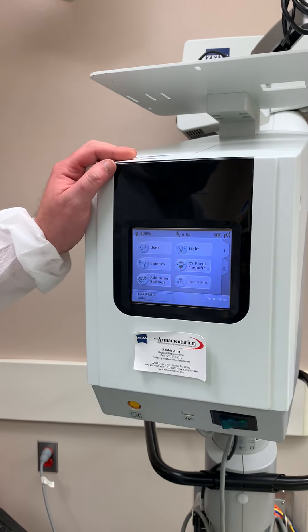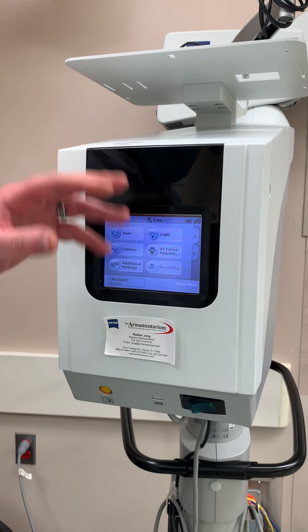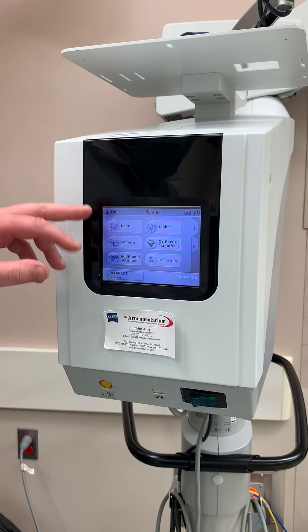This is an in-service on a Lumira 700. First thing you obviously want to do is turn it on. It's going to take a little while to load up. Once it's loaded, it will come to this screen.